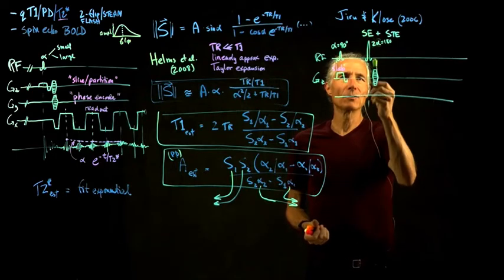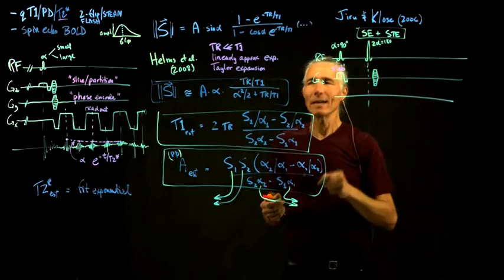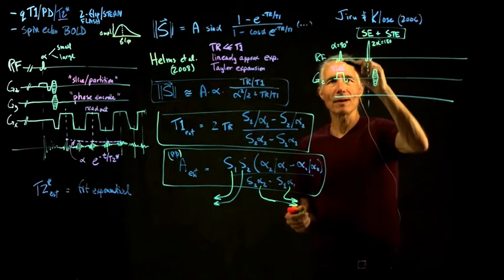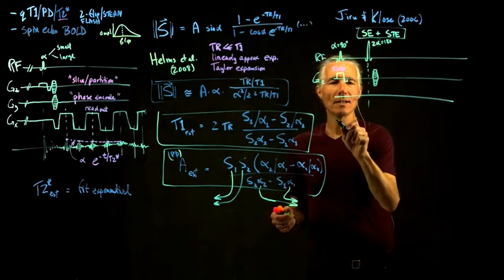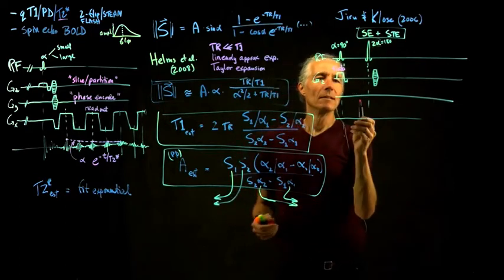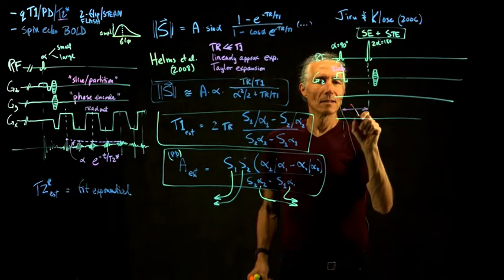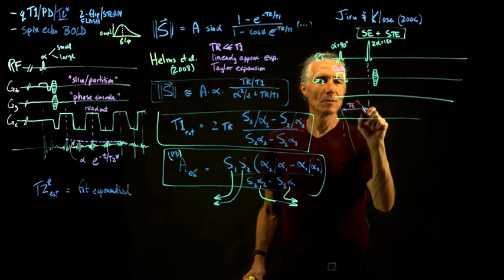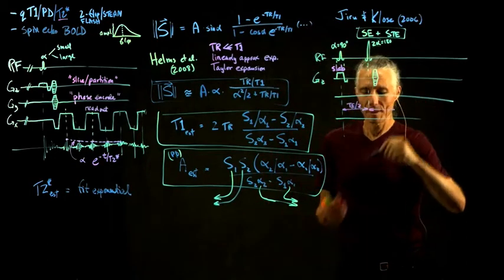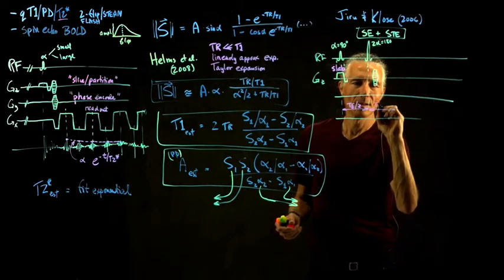And how do you do that? You basically do a 180, and then do an echo planar readout after that 180 at the right time. What's the right time? If this is TE over 2, then that amount of time later is where the spin echo appears.